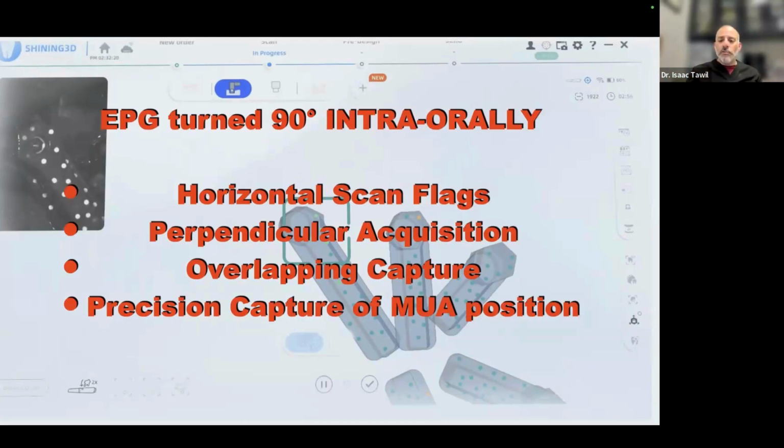That gives us the ability to overlap the capture and gives us the precise capture of not the implants. Never with photogrammetry, unless we're going direct to fixture, do we call it implant position. We call it multi-unit abutment position because what we're really capturing is the multi-unit abutment. So I always recommend telling the clinician, please torque down your multi-units again before you do your record capture. Make sure everything's nice and tight, because what you're capturing is the multi-unit position, not your implant position. So make sure that you have that done correctly.